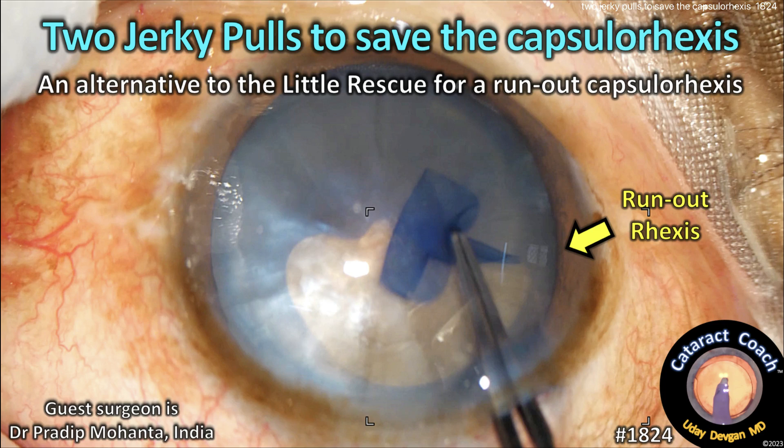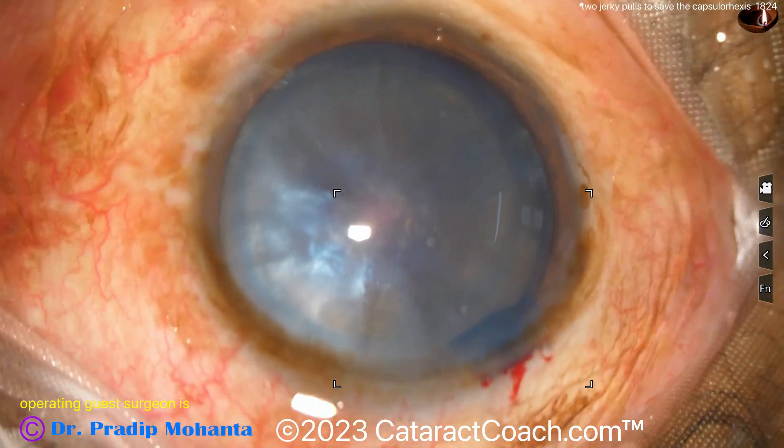CataractCoach.com. Two jerky pulls to save the capsule rhexis. It's an alternative to the little rescue technique for a run-out capsulorhexis.